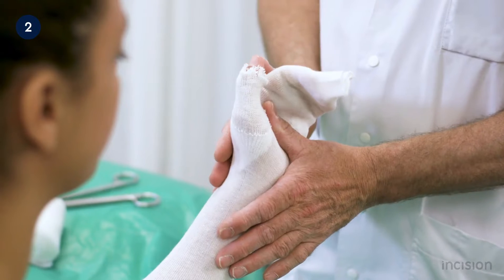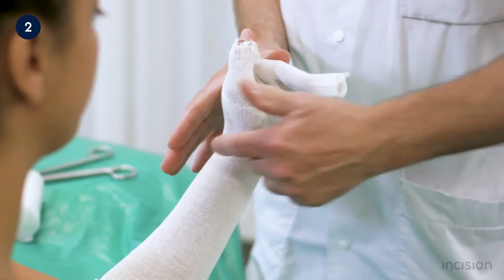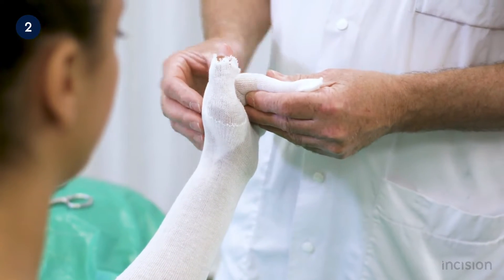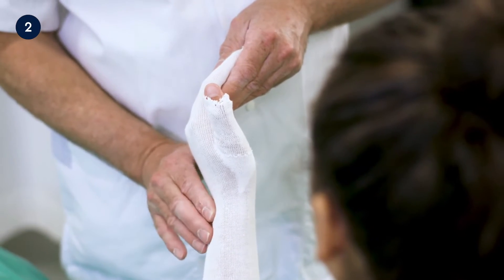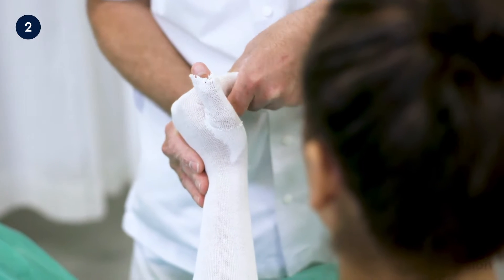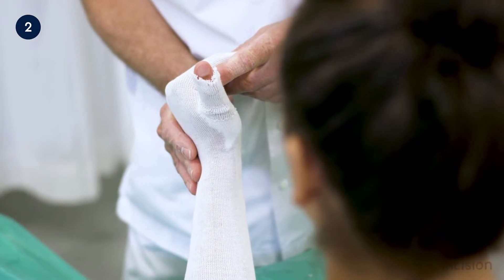After placement of the stockinette, the wrist and metacarpophalangeal joints are placed in the intrinsic plus position. This position prevents excessive stiffness after removal of the splint. The wrist is placed in 20 to 30 degrees of extension, and the metacarpophalangeal joints of the second to fifth digits in 70 to 90 degrees of flexion.